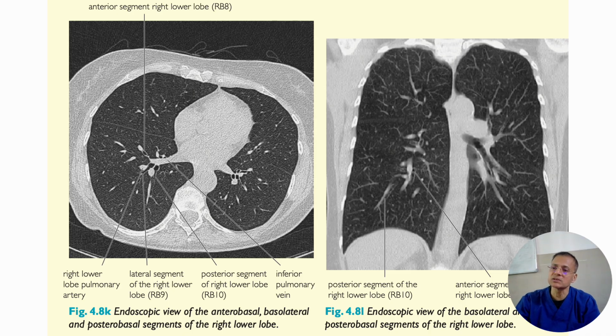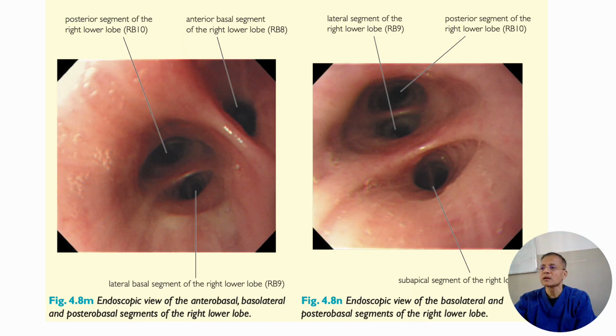Now in the CT image, we have to define the B6 origin, which is at a branch. Then with B8, B9, B10 in the anti-clockwise direction in the CT scan axial film, B7, B8, B9, B10 anti-clockwise direction. So this has been depicted.